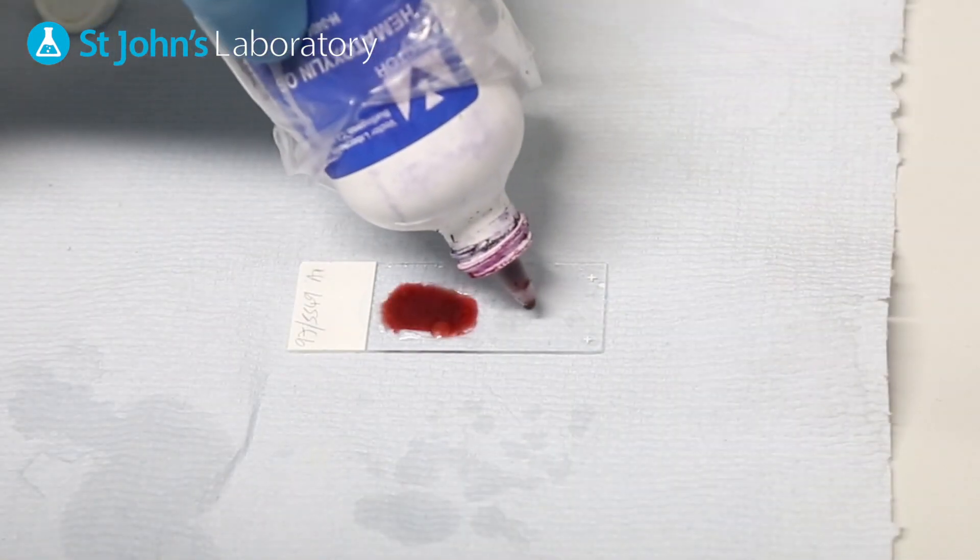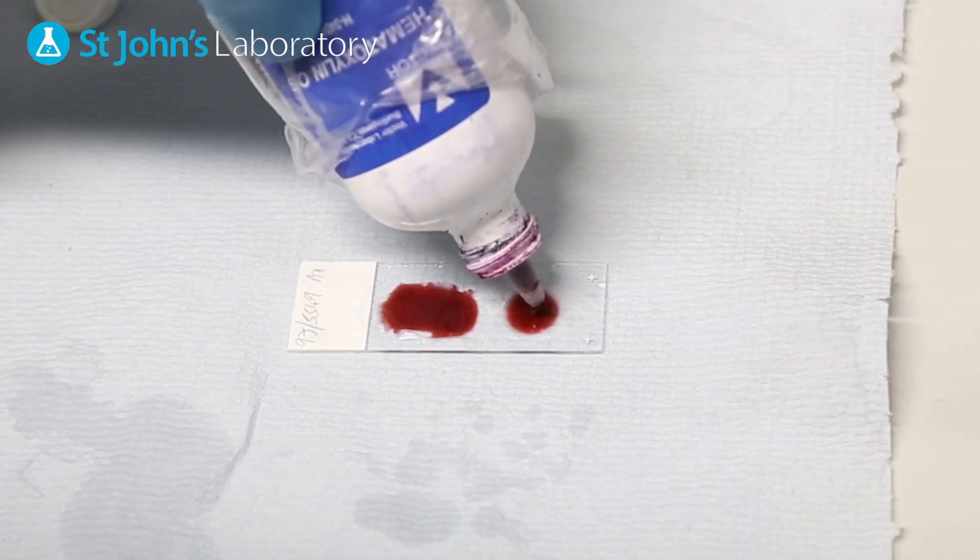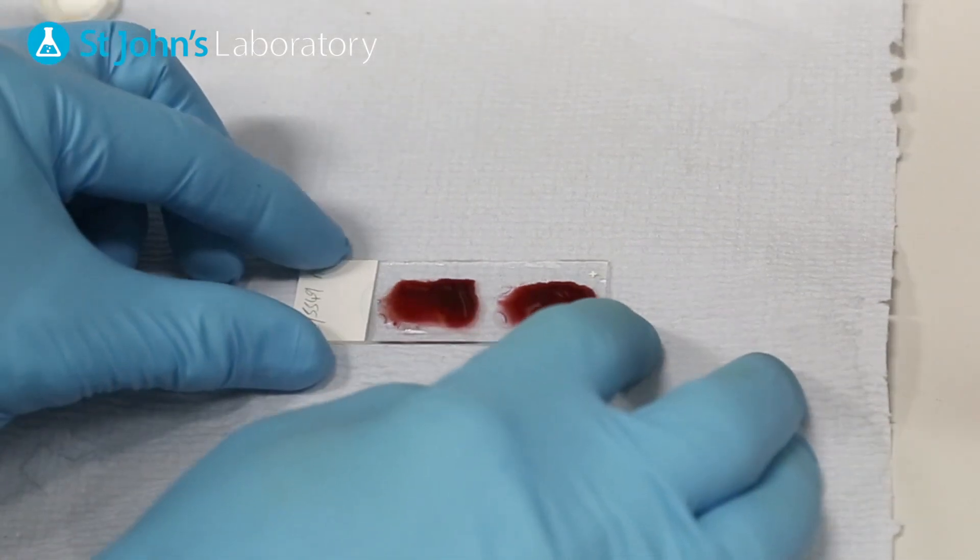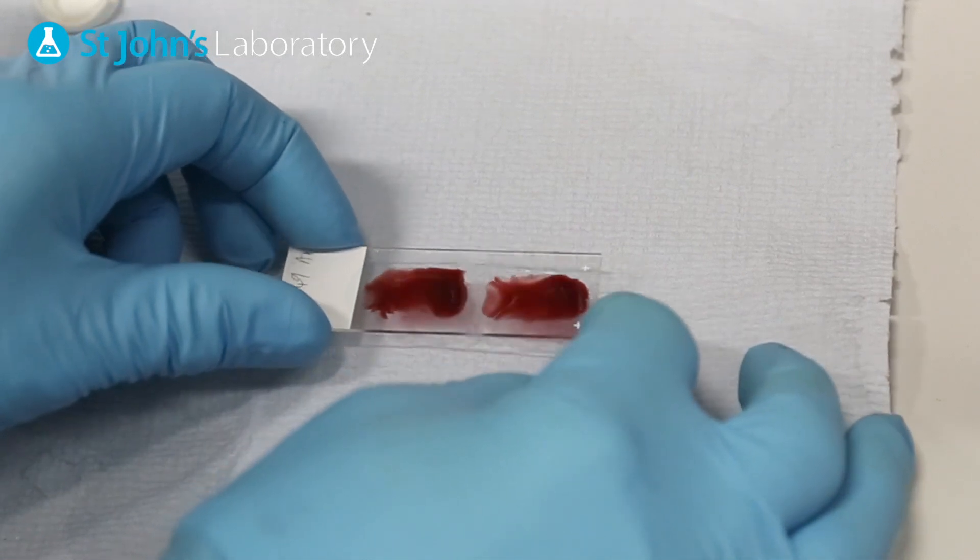Hematoxylin is a nuclear counter stain which binds to form dark blue or violet salts with acidic compounds such as DNA and RNA that hold negative charges. Apply this for 10 to 30 seconds before submerging in distilled water.